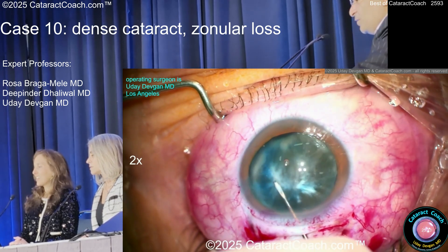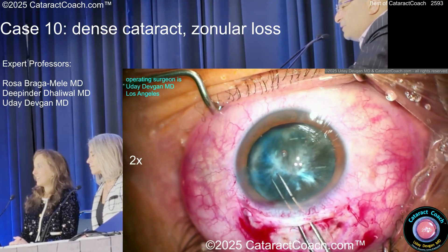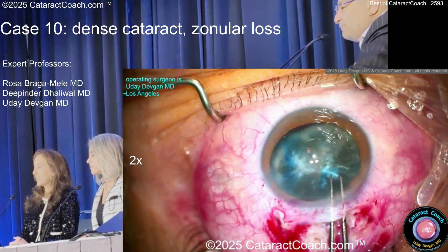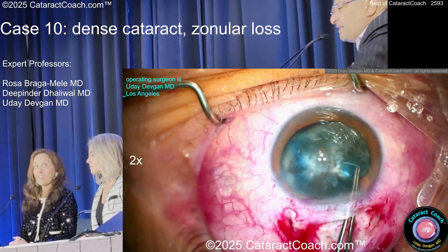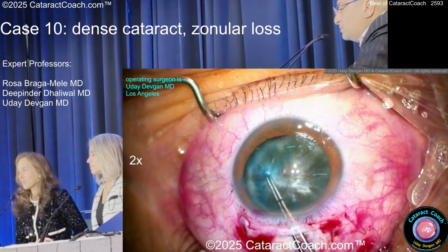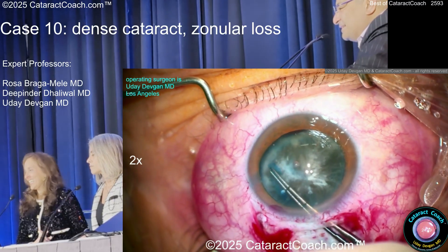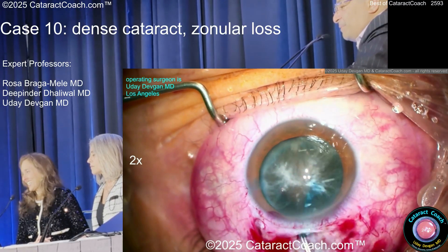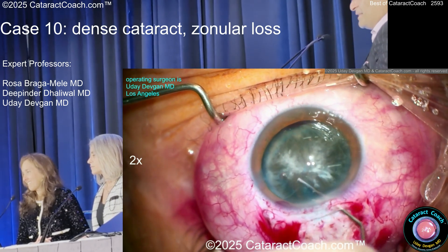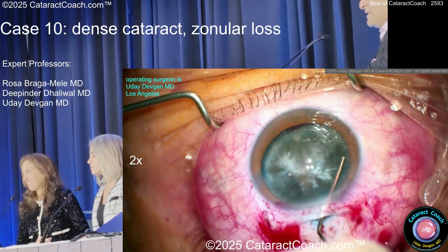Want a juicy rhexis. Interestingly, I get a reasonable-size rhexis even with the weak zonular support — enough to support getting the rhexis done. Grabbing the capsule, making about a five to five-and-a-half millimeter rhexis. For M6 shouldn't it be bigger? I'm still learning. By some miracle the anterior capsule isn't fibrotic, so I'll do some hydrodissection gently, still worried about that area of zonular loss.